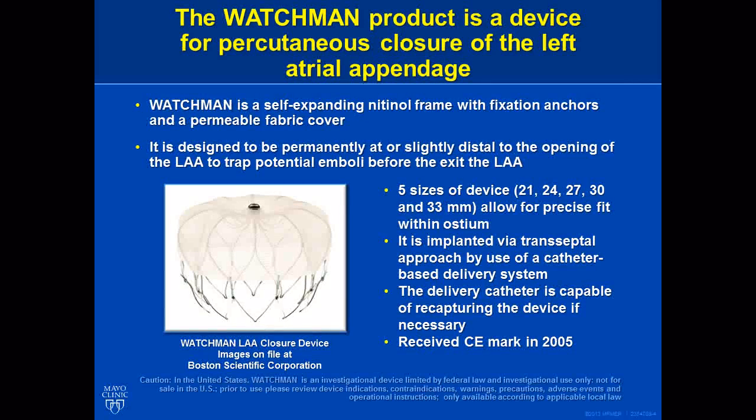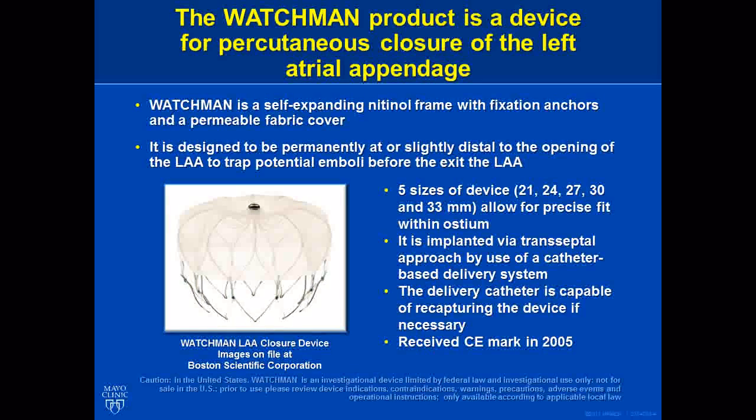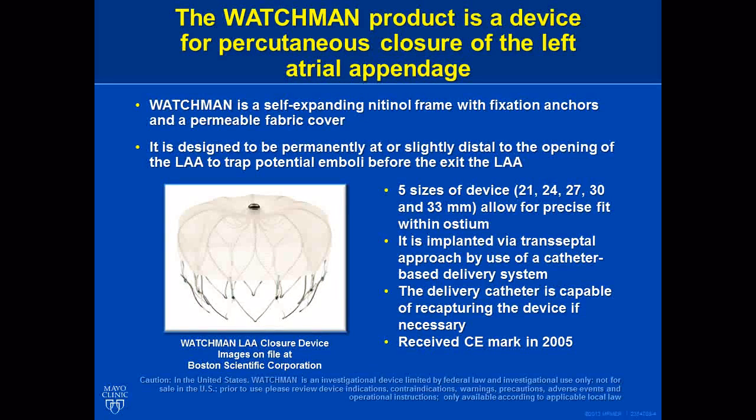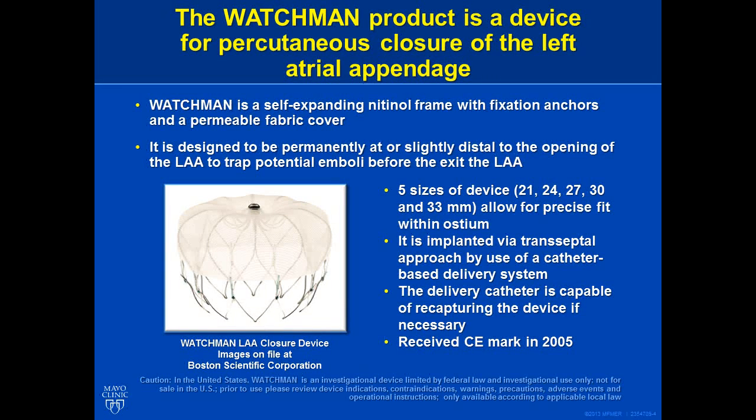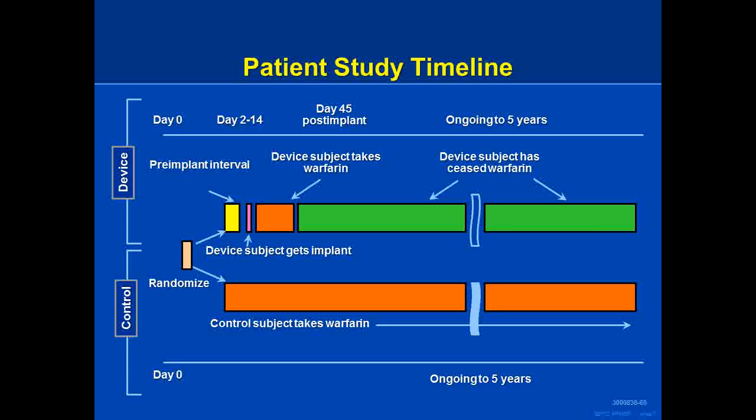You've seen the Watchman device, and it's been shown to you, and so we don't have to spend any time on that, other than to say that Ted Feldman this morning talked with you about Gen 4 and Gen 5, and so this is technology that we haven't yet seen in the United States, that we will see in the United States as technology continues to improve going forward. This is an important slide. Ted showed this. It has some important implications.